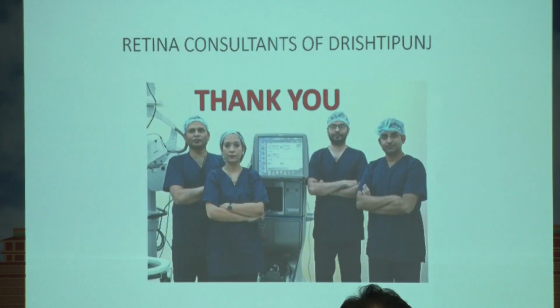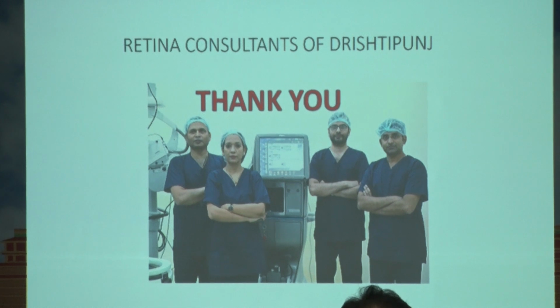Silicone oil was removed, and later on the patient developed cataract. Cataract surgery was also done, and for the last 1.5 years the retina is absolutely attached with a good outcome. So thank you so much. I just wanted to show this technique to manage posterior breaks of the retina.